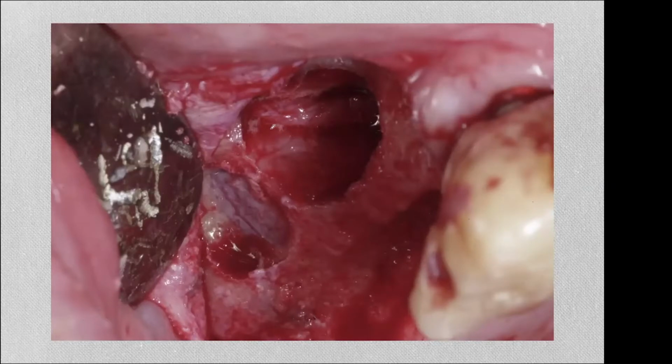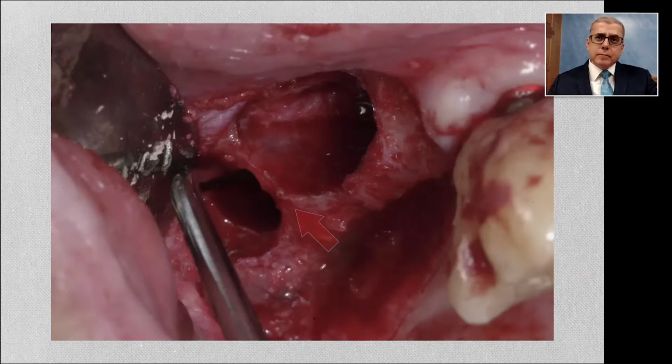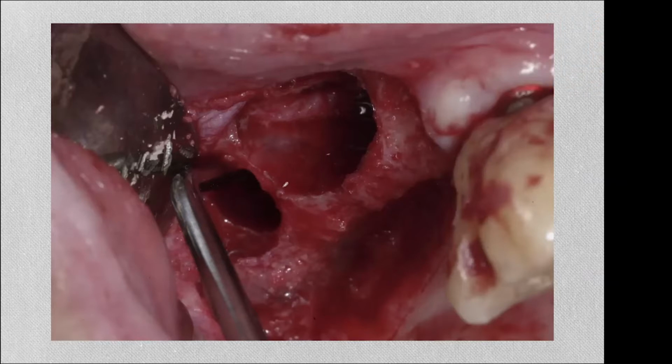And surgically, we could not bridge over the gap, so we ended up doing two side-by-side lateral sinus lift windows as such. So recognize the presence of these septa. If we are trying to fracture the floor as we do for internal lifting, and you come right at this septum vertically, it becomes a very significant thickness of difficult bone to fracture. So you do not want to try to break that. It's unpleasant for the patient and it's fraught.